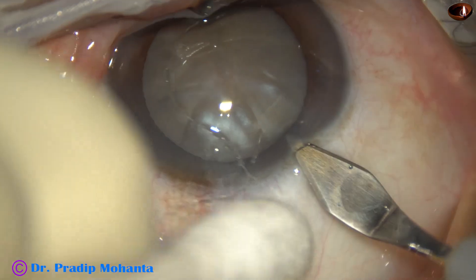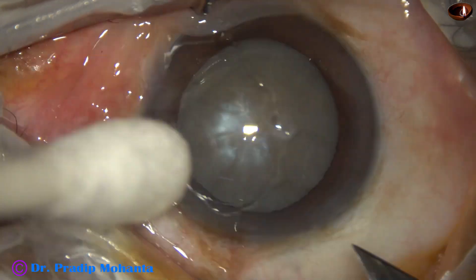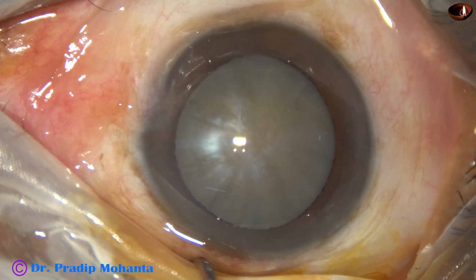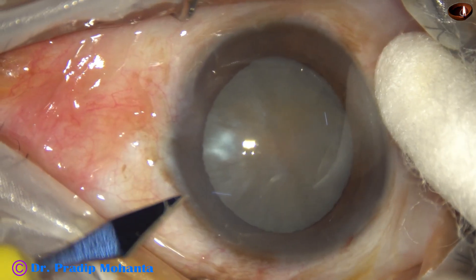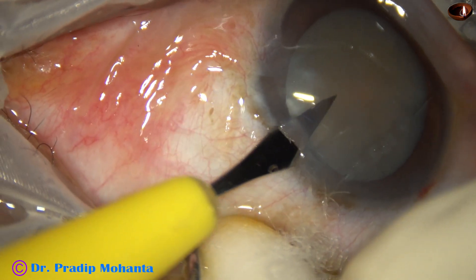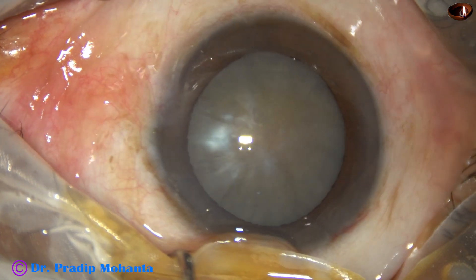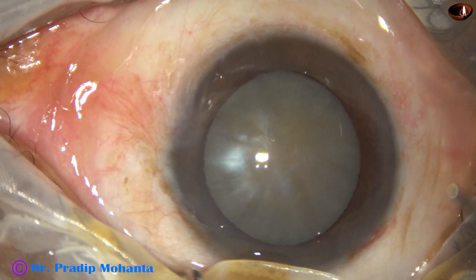This is the main incision with a 2.8 millimeter steel keratome. A side port is made on the left side of the main incision. I'm using a cotton-tipped Johnson bud to support the eyeball. I'm not using any forceps.